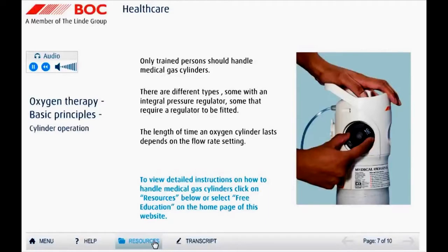The length of time an oxygen cylinder lasts depends on the flow rate setting, so the contents gauge will need to be checked before and during operation to ensure there is sufficient gas for treatment. To view detailed instructions on how to handle medical gas cylinders, click on Resources below or select Free Education on the home page of this website.